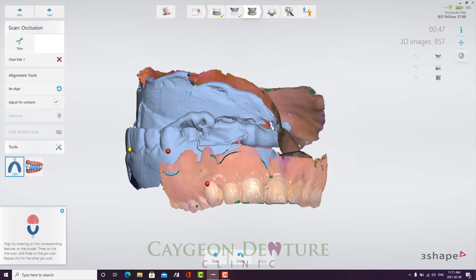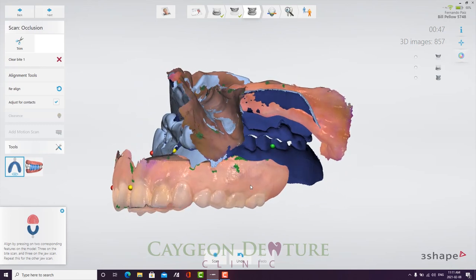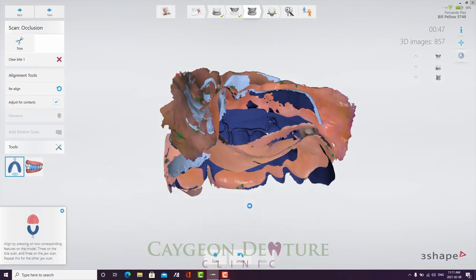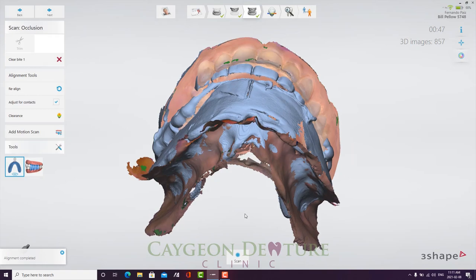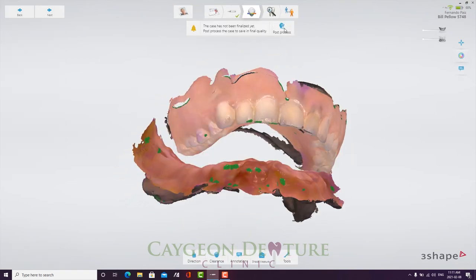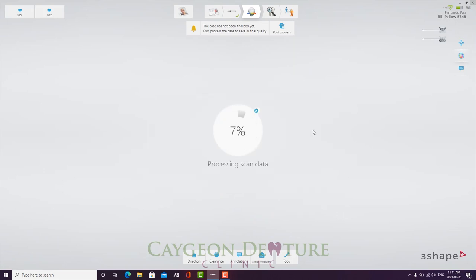I'm not sure if this is a glitch in the Trios software, but I was not able to align properly the complete upper denture against the bite scan, but not to worry. I still continue to post-process the scans, so then I can go ahead and move it over to 3Shape Dental System, and then I was able to align everything properly there.